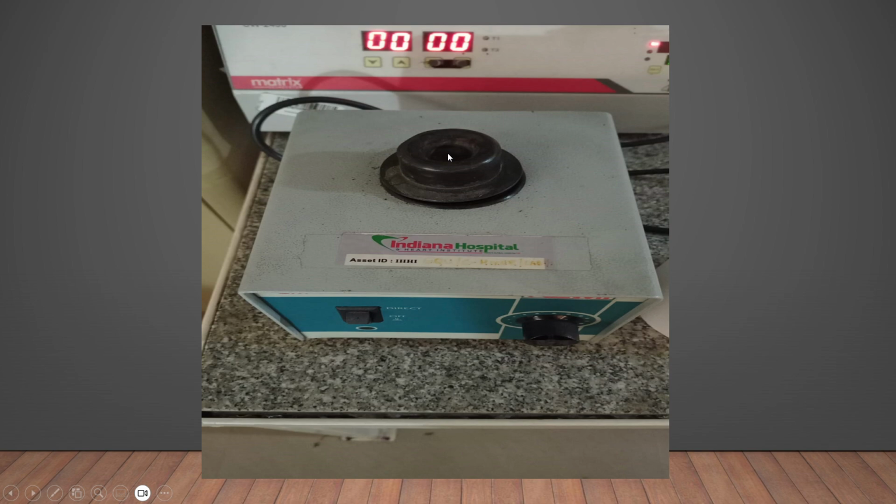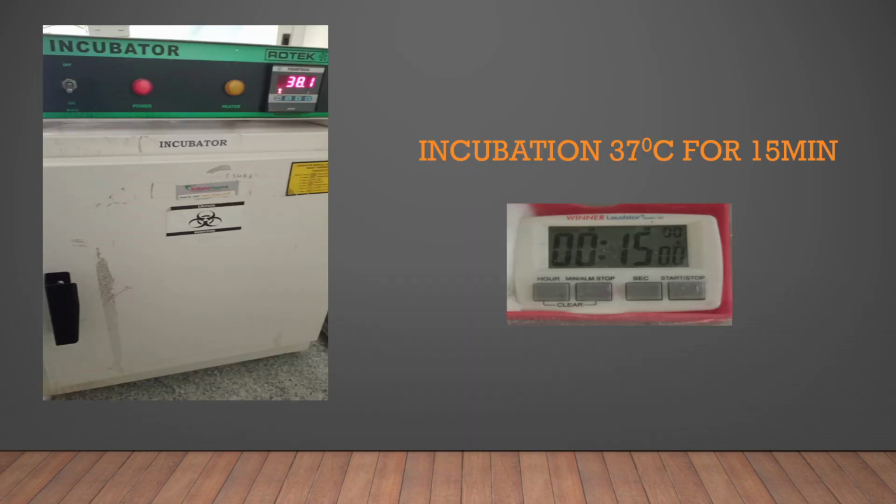Make sure that the pre-treatment solution and the sample are well mixed, and as much as possible some amount of fluidity is created. After that keep it at 37 degrees centigrade for 15 minutes. This is fixed. You can keep it for say 17-18 minutes also. Sometimes we keep it for 20 minutes also when a mucoid solution is there. But remember that the solution should not be used after the 40th minute.